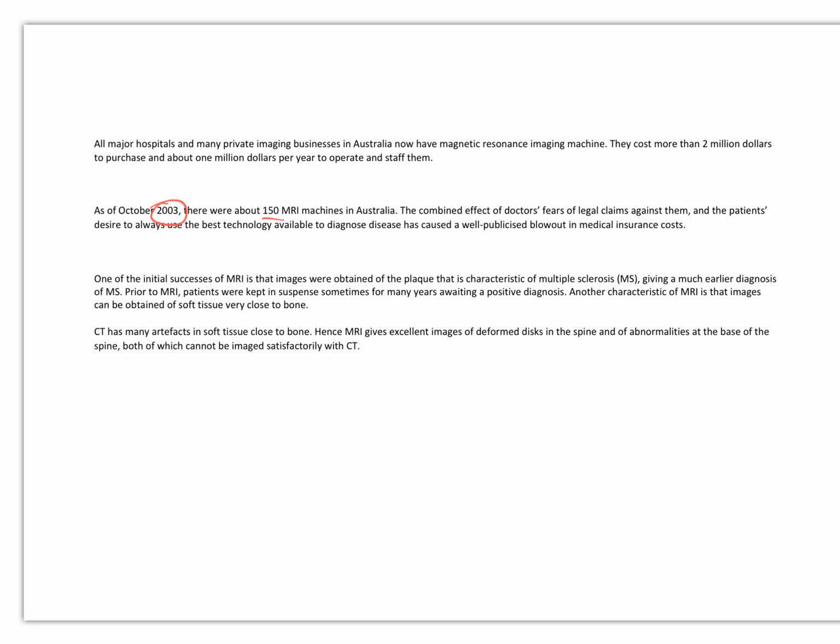We get excellent images from MRI. MRI machines also help us to diagnose diseases that up until the use of MRIs have been difficult. It might not show up on a PET scan as well, and a structural imaging device like a CAT scan might miss it because of lower resolution than MRI. Remember, resolution is just the ability to show or define the difference between two points. So, a higher number of pixels, or voxels as they're called in MRI machines.